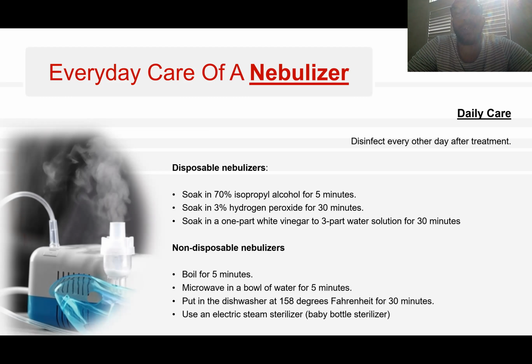Now, I haven't seen hydrogen peroxide inside of a medical facility available for staff to use, but I have seen alcohol and I have seen white vinegar. So just ask your manager or whomever what is the requirement. How would they like you guys to handle this? But be mindful that if you are using disposable nebulizers, then you should be disinfecting every other day after treatment.